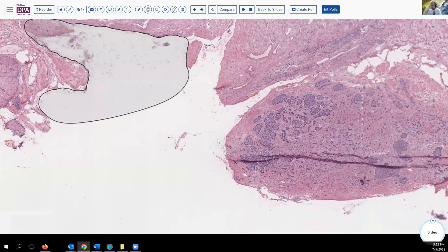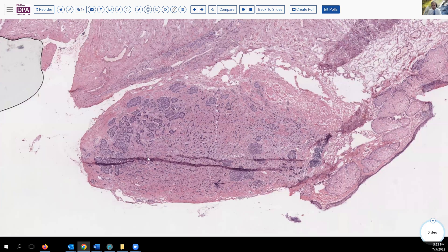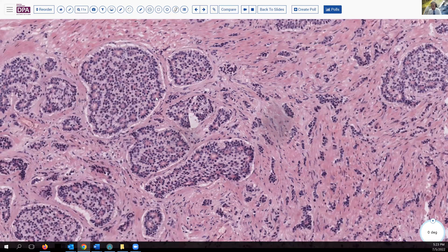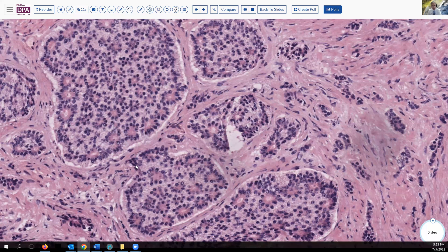You always want to look around and see what you've got and sample the more solid portions of the lesion. This little nested group of pink cells attracted the eye of my colleague who looked at the case this day. As she was looking at this, she noted in particular that it looked like we had lots of little rosette-type structures. And that, of course, in this environment, raised concern for an immature teratoma.